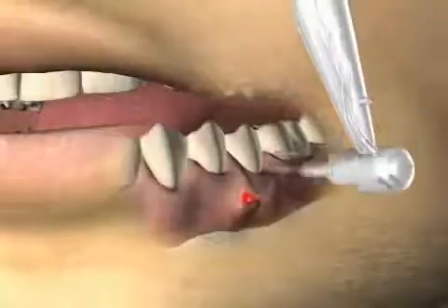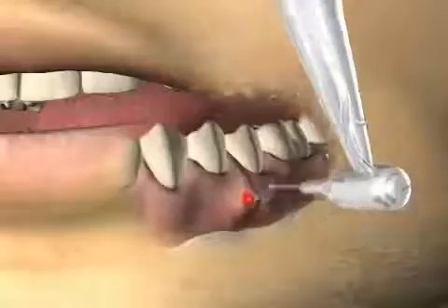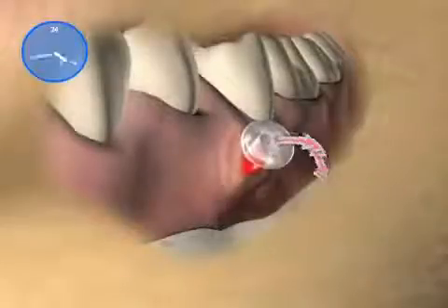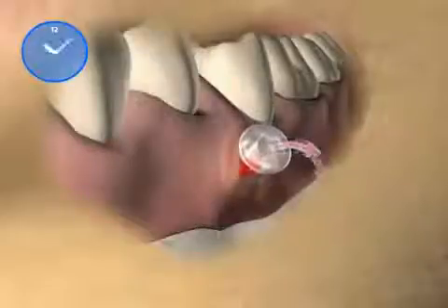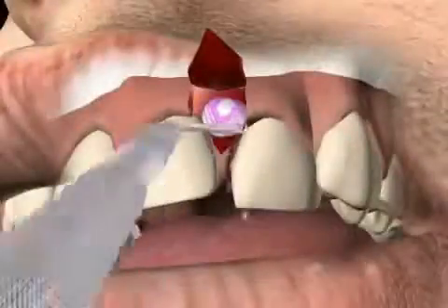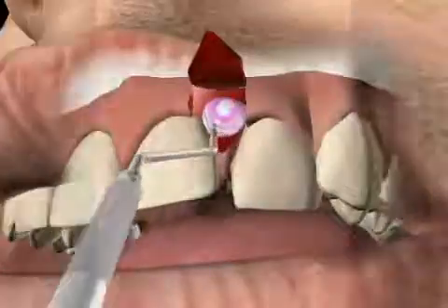A hole will be drilled in the cyst and a drain, in this case a tube, will be inserted which will communicate with the outside, in this case with the mouth cavity. In this way, the cyst will get smaller and smaller over months. Think of it much like a balloon from which you let the air out bit by bit. When the cyst or the balloon will have reached a certain size, the cystectomy can then take place. Cystectomy is the removal of the cyst. You can find out more about it in the video by the same name.